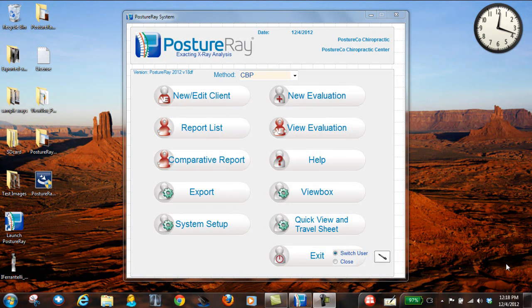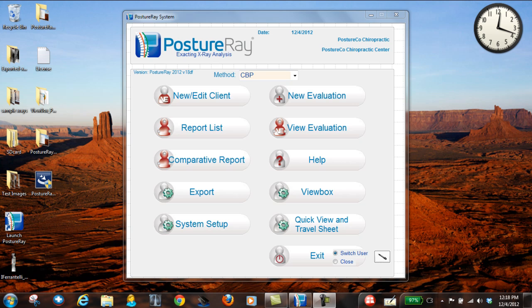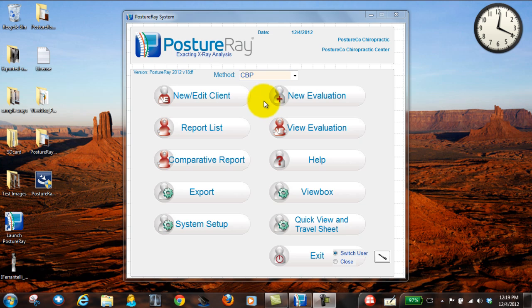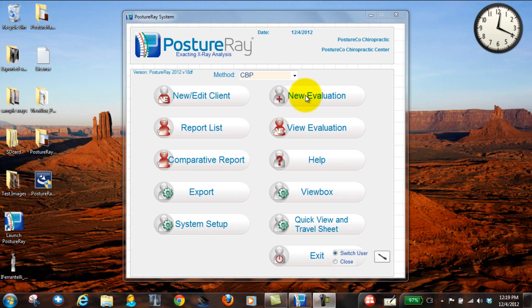The first thing I'd like to do is show you how to pull in images. I'm going to start with digital images, either from a CD or from a digital X-ray server that you have on site if you have your own digital X-ray system. So I already have the client in there, so I'm going to go ahead and hit new evaluation.